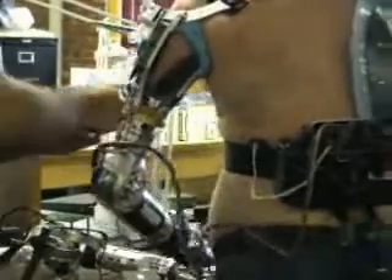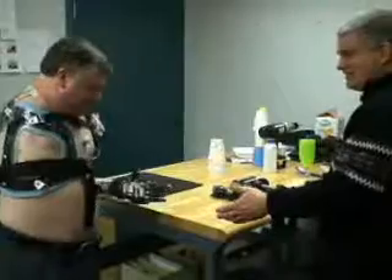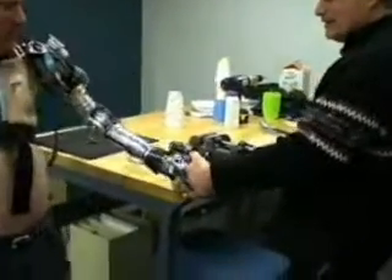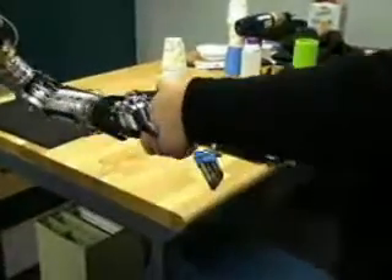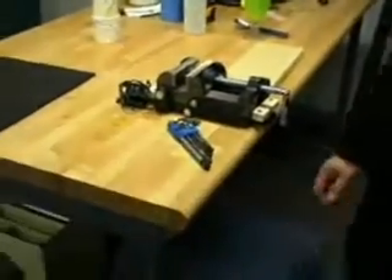...which then goes to a small vibrating motor. The harder they grip, the higher the frequency of vibration becomes. So it gives them direct feedback — so they're gripping. Lots of practice. Good grip strength. It does have a good grip strength.